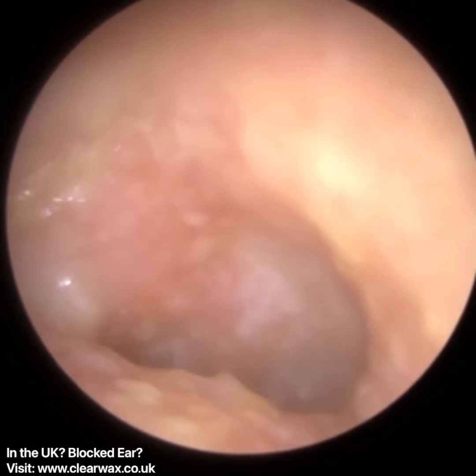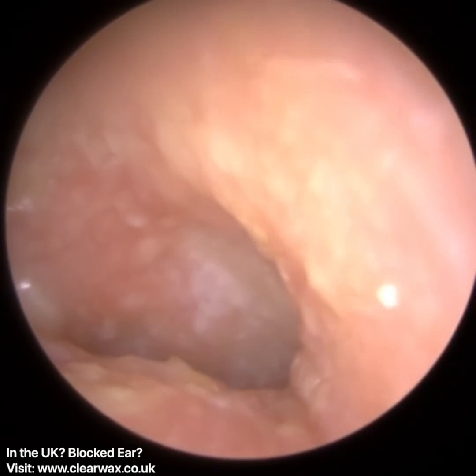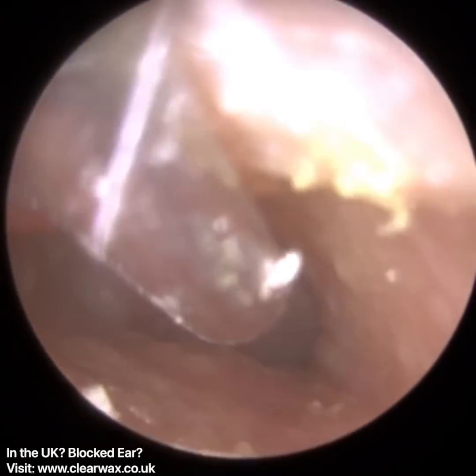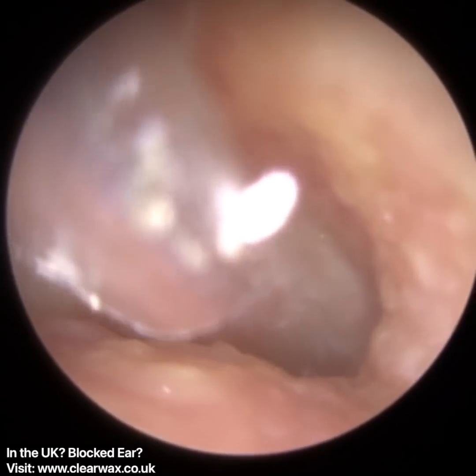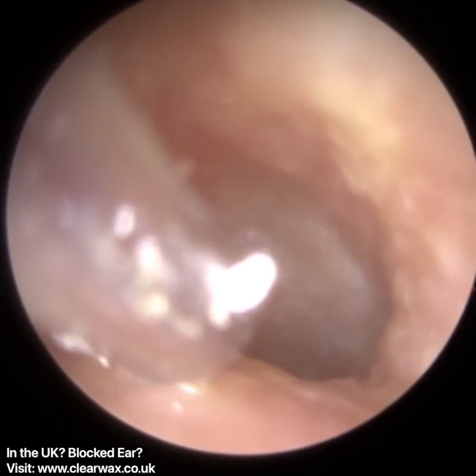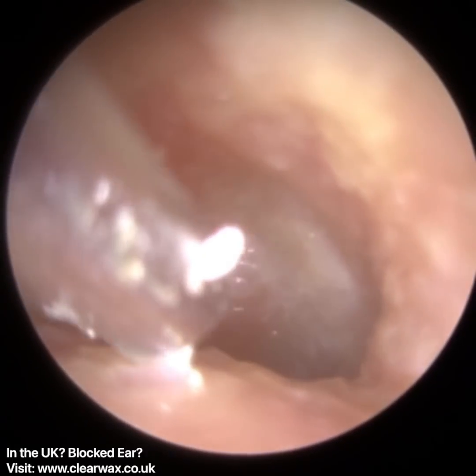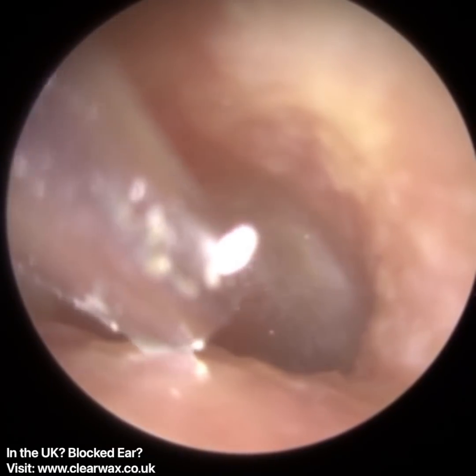That alone itself can help stop the bacteria from sometimes reproducing. That they might need a few appointments. So if we left this ear, what we're doing today is clearing the discharge and the dead skin that's lining the ear canal and the eardrum. Now, if we were to just leave this ear without the patient using any medication, it's very likely that all this discharge infection will come back.